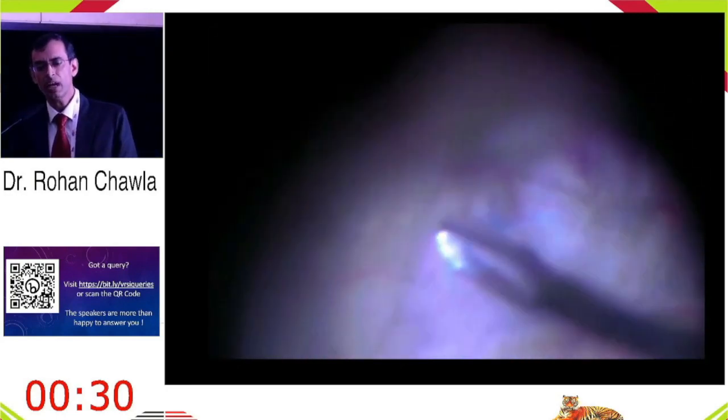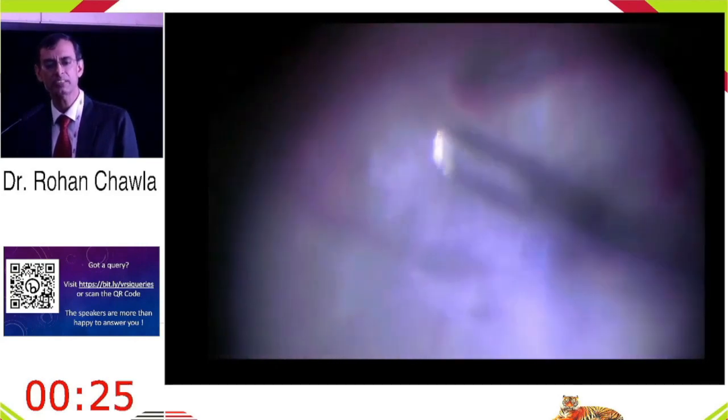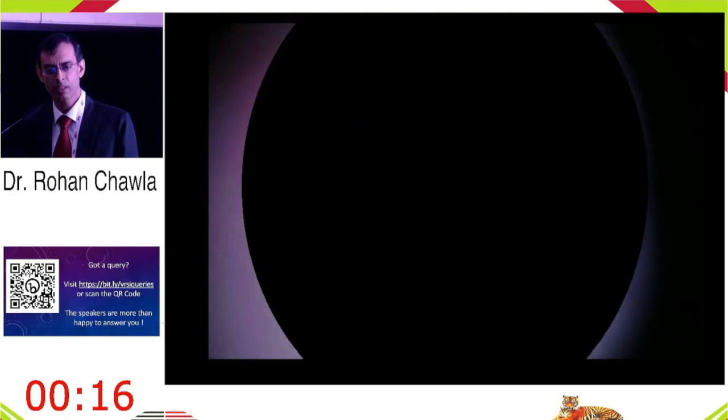Now if you feel that I'm having problem identifying a plane of entry there, I simply go to the periphery where the membrane is thin and I start peeling there, and along with the ILM, I'm going to start peeling the membrane from the side and bring it on to the center. Again, the OCT was not going to show me that area, that plane. And again, the peripheral attachments, I have to use my own experience to be handling them also along with handling the central membrane and not just keep pulling on the central membrane. Otherwise, I might create a peripheral break somewhere.